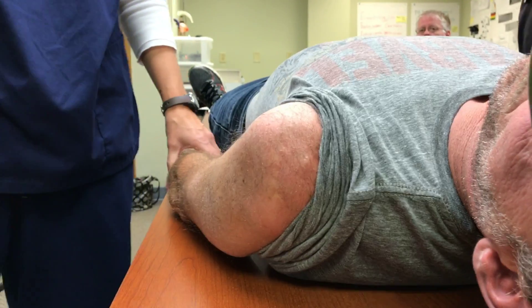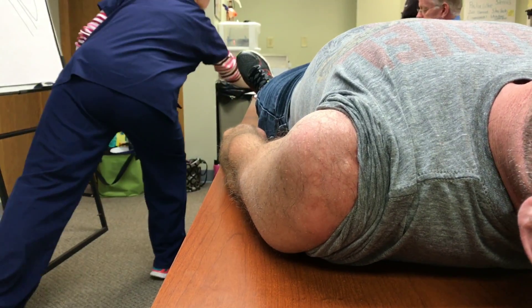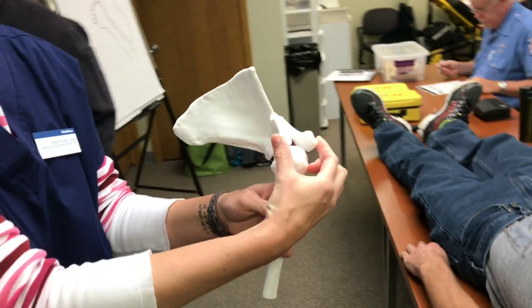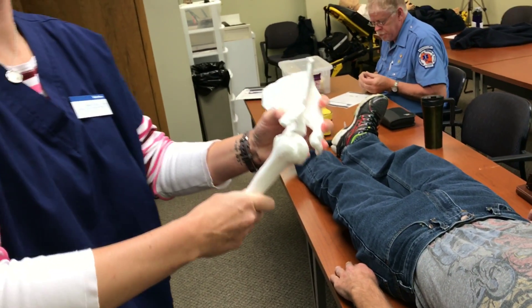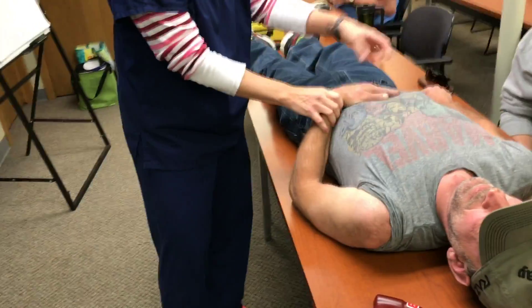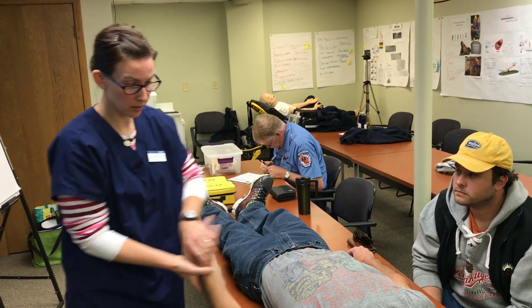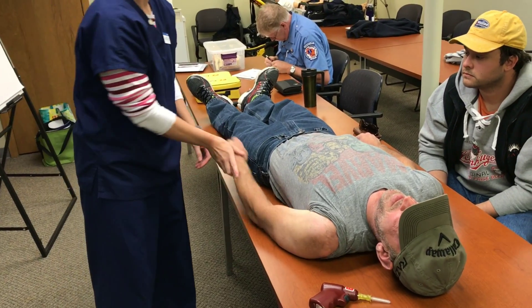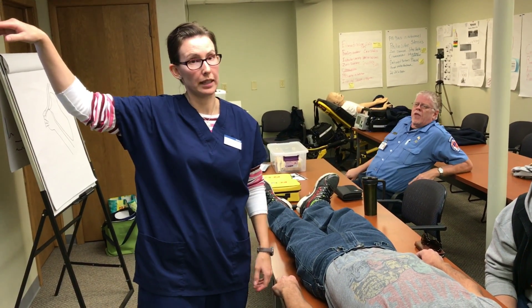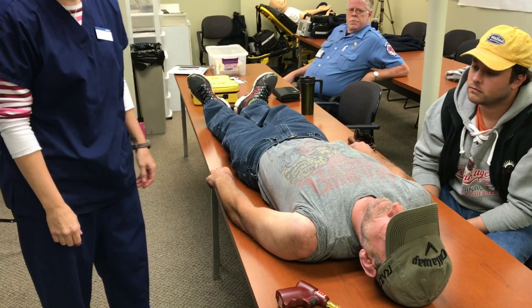Once the IO is in, the arm can go back to resting position. What the patient cannot do is abduct more than 45 degrees — the needle runs through the space and rotating the shoulder out can bend the needle against surrounding bone. So tape the arm to the side, put their hands across their belly and tie them together, or rely on backboard straps. Minor movement like this is fine; it's when the arm goes way out that you risk bending the needle.